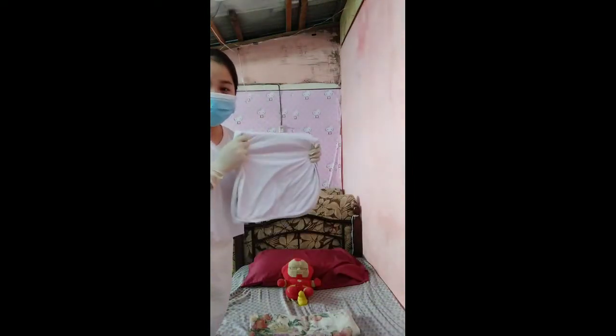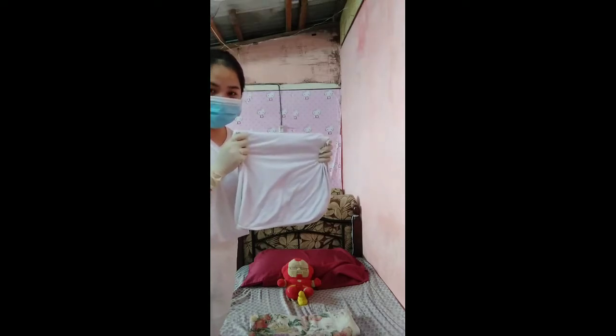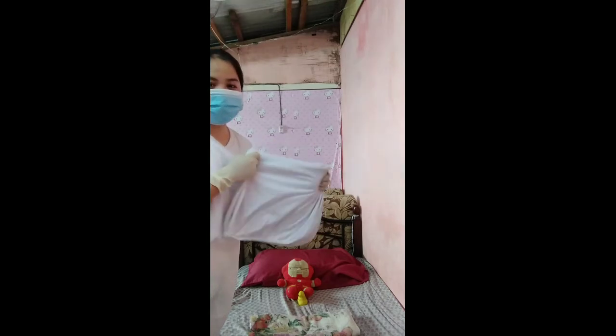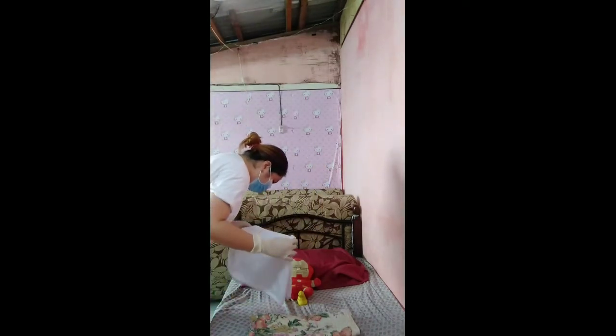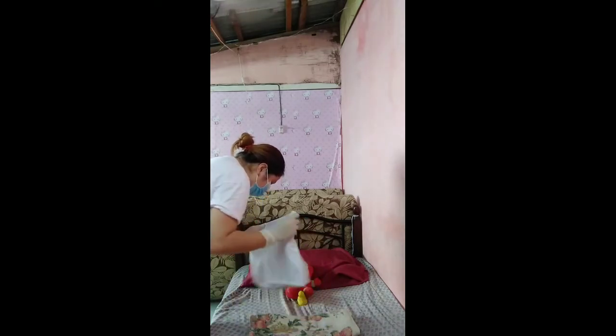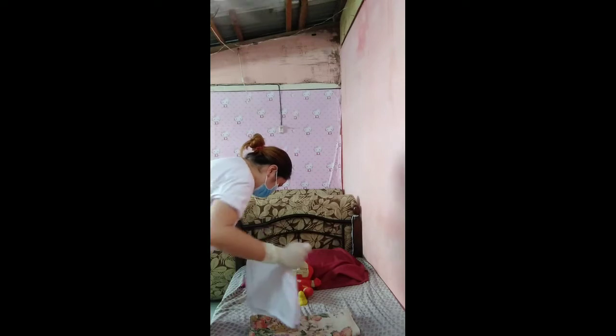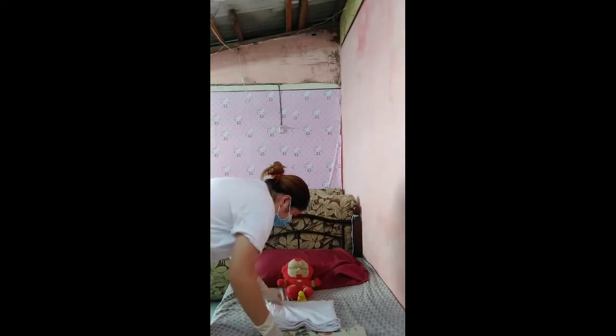Thank you. After putting on sterile gloves, we need to place the sterile pads under the patient's buttocks. This is an improvisation of the sterile pads. We assume that this is a sterile pad. So may I ask you, sir, to raise your buttocks a little bit, and I will insert these pads under your buttocks. Good.